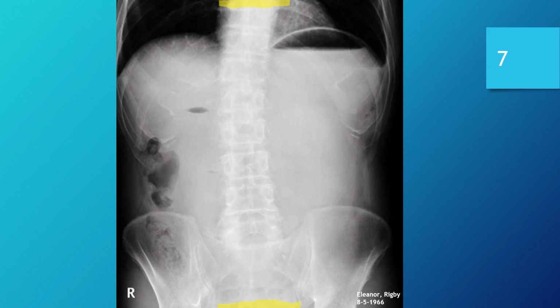So, just another visual clue that we're dealing with an upright abdomen. In all honesty, it is actually the only clue that you get that this is an upright abdomen, and that is a very, very pronounced area of air fluid in the patient's stomach right there.